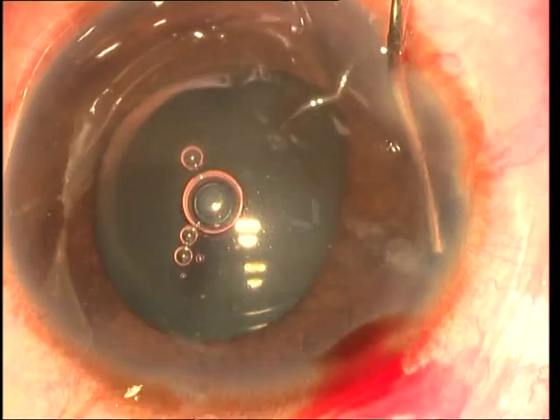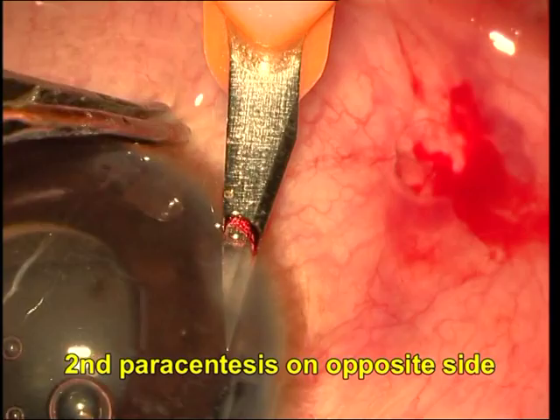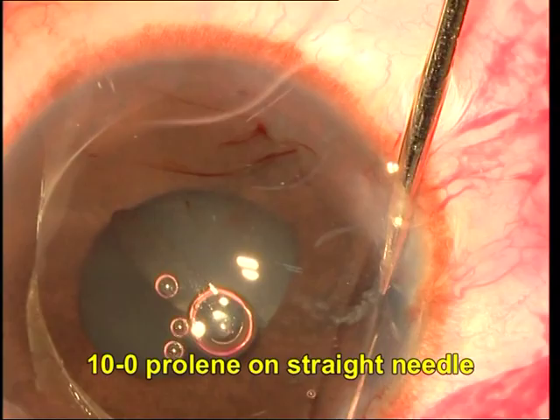You must not go in and touch the anterior capsule with the sharp needle you're going to use. What I've done is instilled viscoelastic under the two leaflets of the iris on either side of the peripheral iridectomy, in an attempt to lift the iris up and forwards away from the crystalline lens.